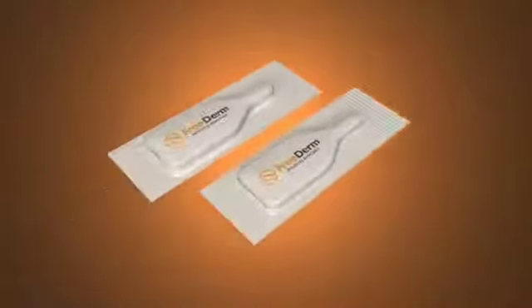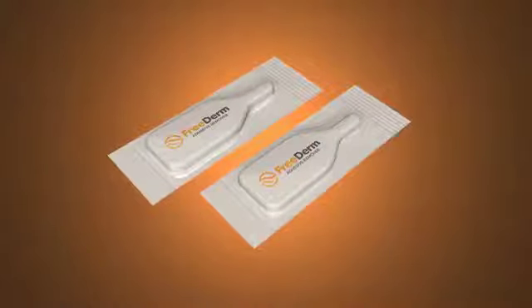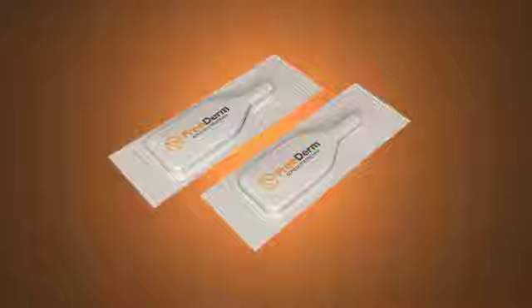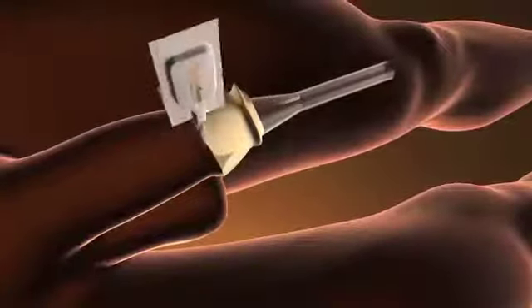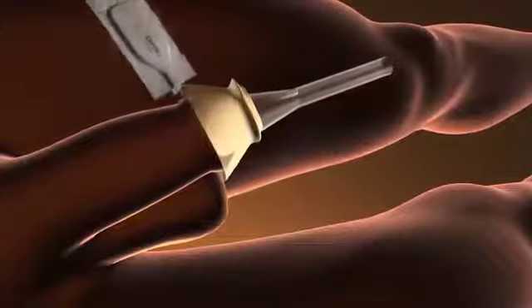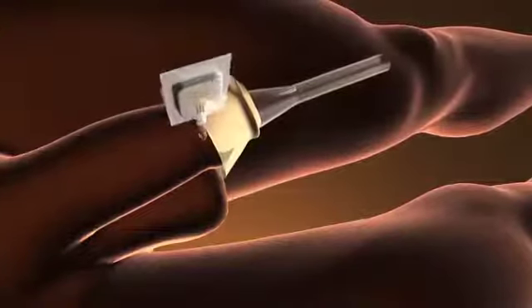For added comfort, use Free Derm Ampules to instantly loosen the adhesive for a pain-free removal. To use Free Derm, apply at the edge of the adhesive, lifting away from the skin as it releases. Continue until entire adhesive has been removed.